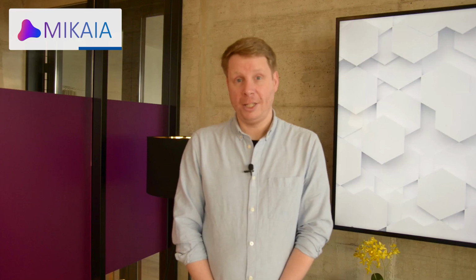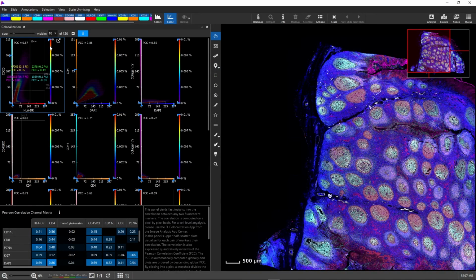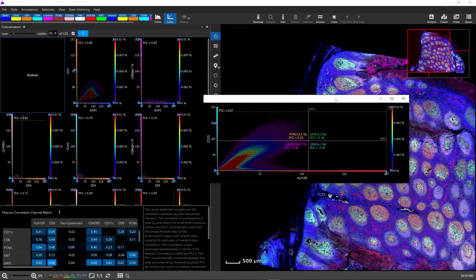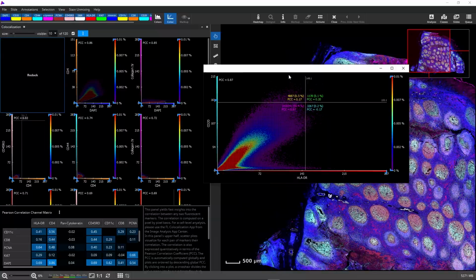Yeah, another advantage is that if you work digitally, there's really no bias. So the analysis is really objective. It doesn't matter if you count cells in the morning or in the afternoon. You will not intentionally or unintentionally change your criteria halfway along the analysis. So really the same criteria will be used throughout the entire analysis, and in the end you really have objective data.